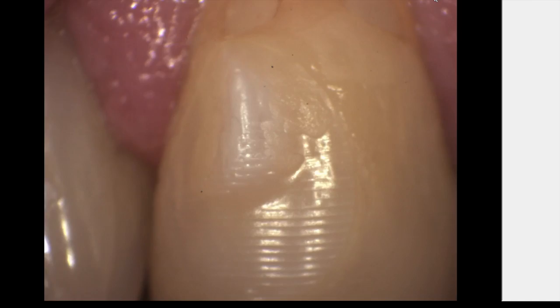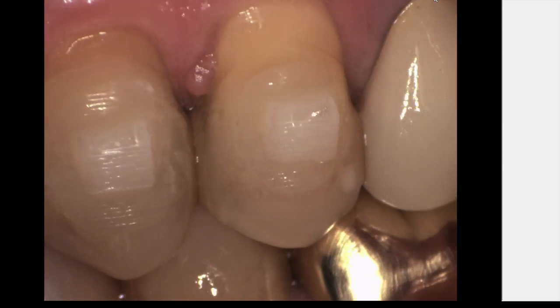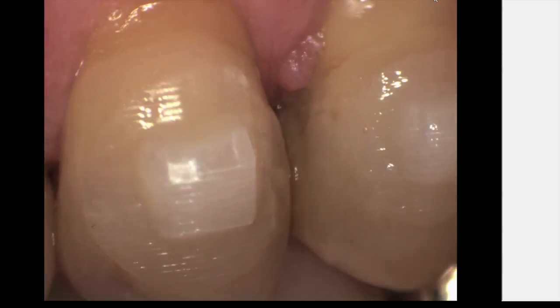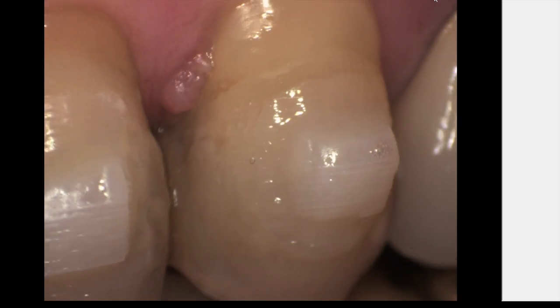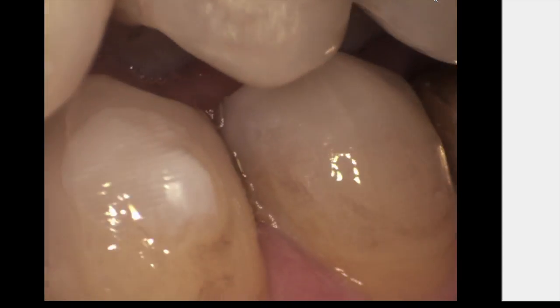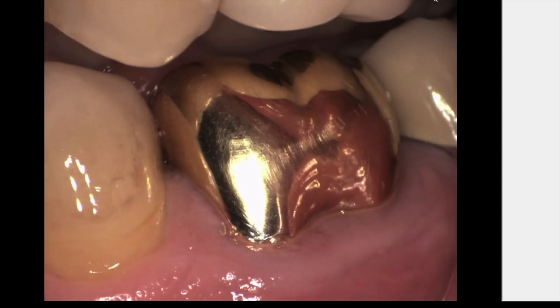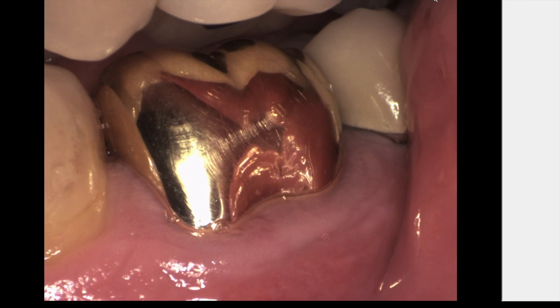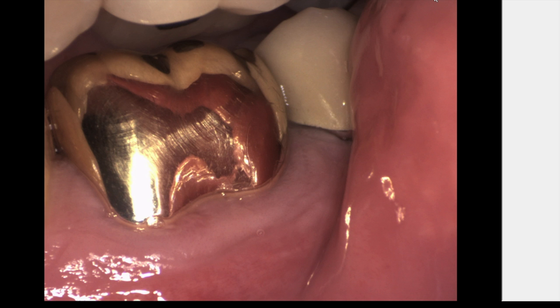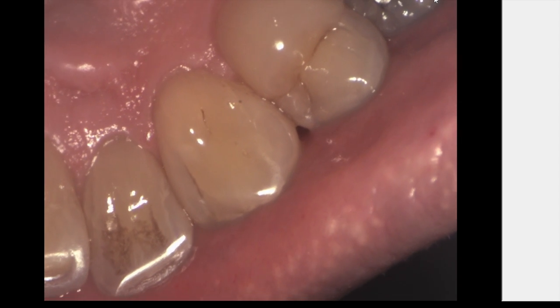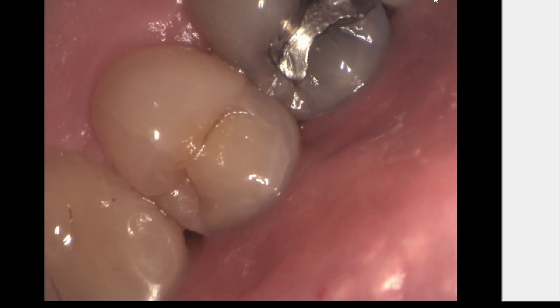The x80 allows you to share a through the loops view of the patient's mouth with them, allowing them to understand better your treatment plan and the urgency that you are expressing to them about how soon it should be scheduled and completed before more dental issues can arise from something now that could be corrected easily and quickly.